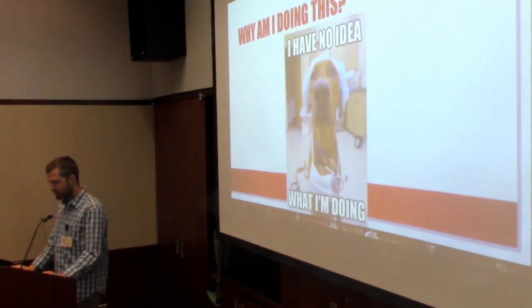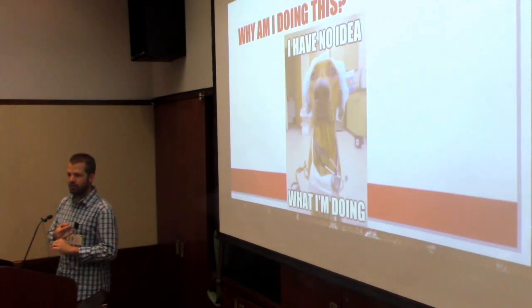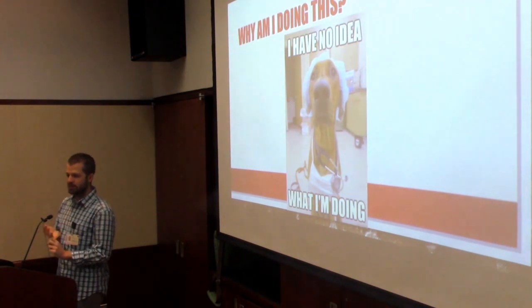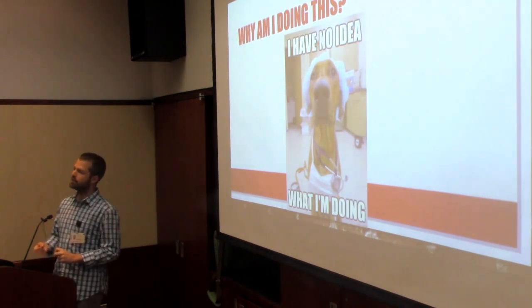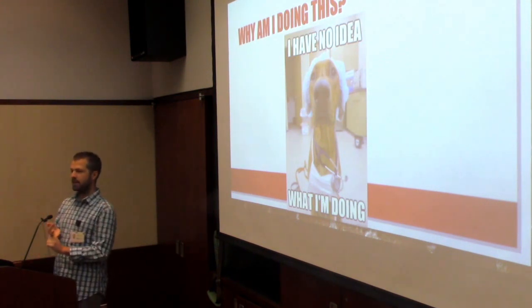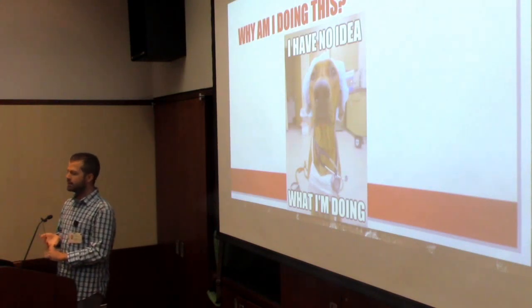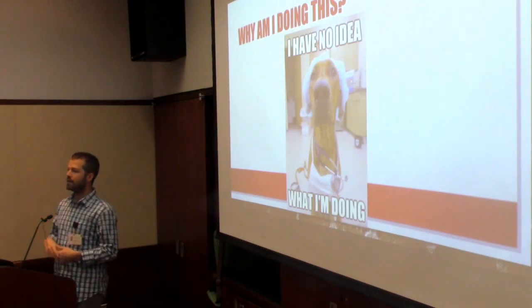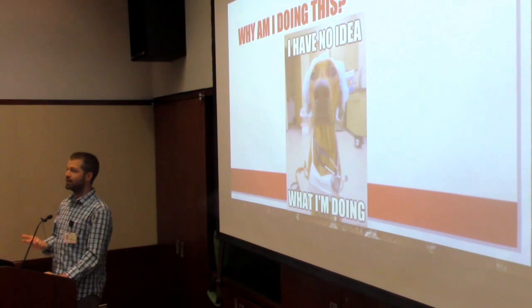So we're going to go over preparation. So why am I doing this? When you're going to stick a needle in someone's arm, neck, whatever, you should think about why you're doing it. Is it to give medications? Is it because the floor team insists they have to have an IV to go upstairs and they're refusing the patient otherwise, even though that makes no sense? You have to decide why you're doing it, and that will help guide you with what tools you're going to use, where you're going to put it, and how long you want to leave it in.